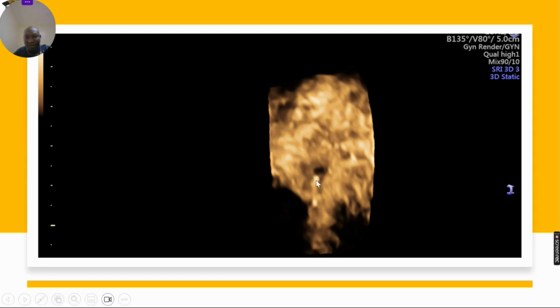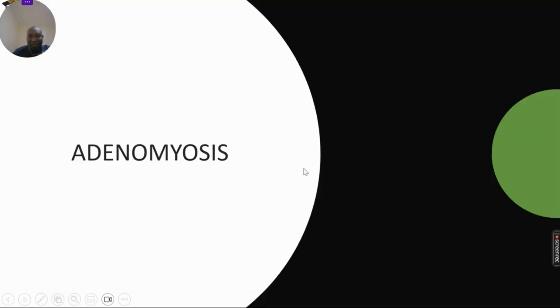This is subendometrial fibrosis. You can see the endometrial cavity clearly outlined, but this is subendometrial fibrosis in the basal layer, commonly associated with manual removal of the placenta.